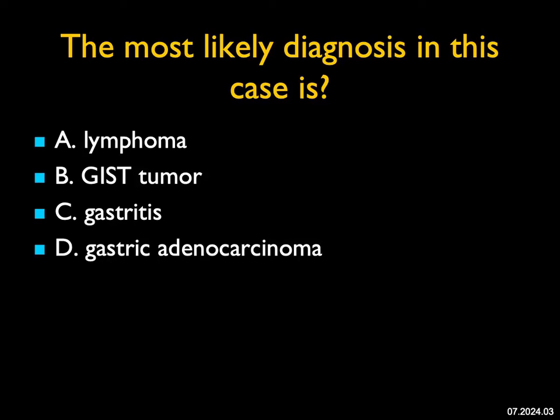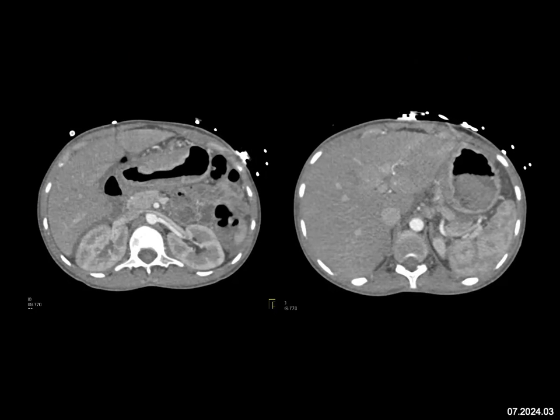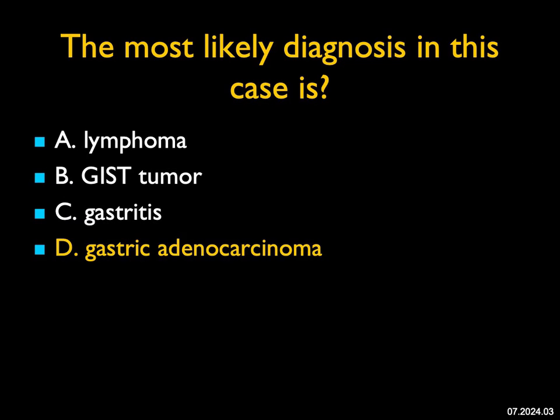The most likely diagnosis in this case? What I see here is a bulky ulcerating gastric mass. This could be lymphoma — lymphoma has a range of appearances and they're usually bulky with large nodes. This is not the appearance of a GIST tumor, though GIST tumors can be intraluminal; they usually aren't so long. This is not gastritis. The most likely diagnosis here is a bulky gastric adenocarcinoma, which this was — but if you said lymphoma, I couldn't argue with you.